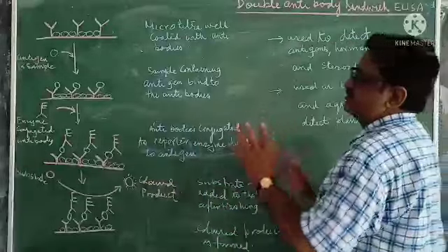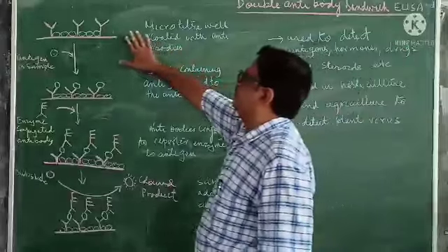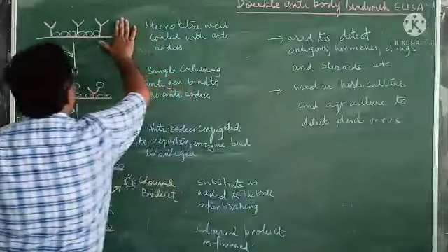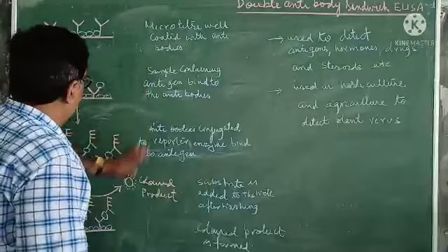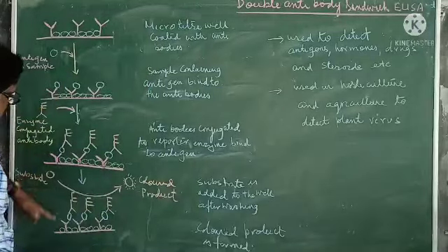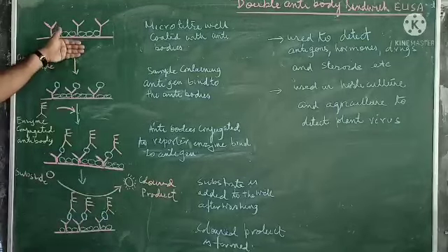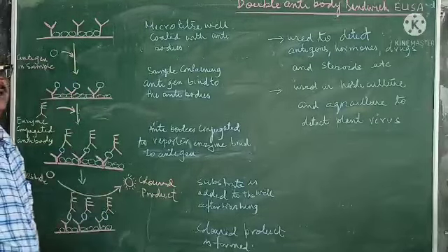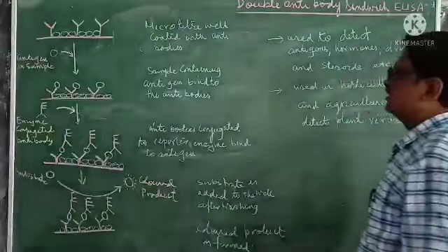Why it is called double antibody sandwich ELISA, we will explain and you will understand. I will explain it through this diagram. This is the four-part diagram. It represents the four steps in the process of double antibody sandwich ELISA.